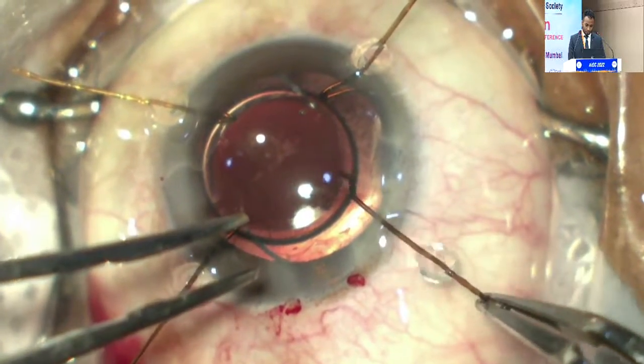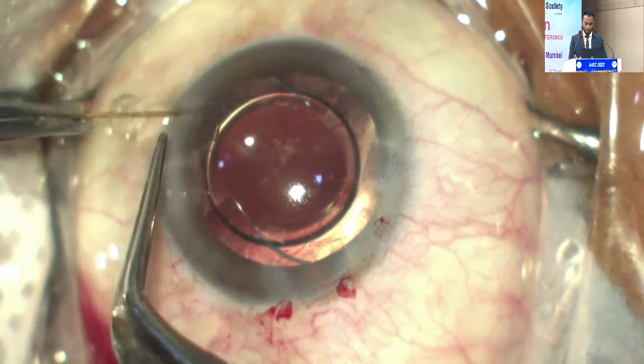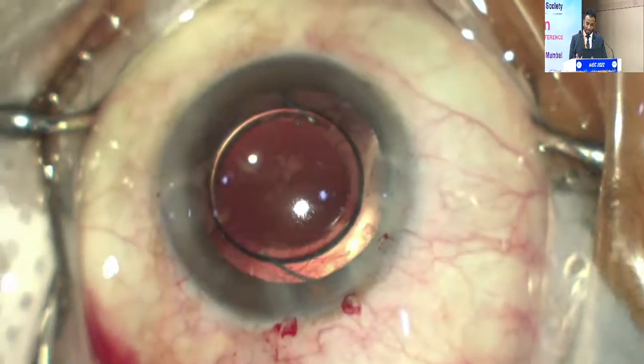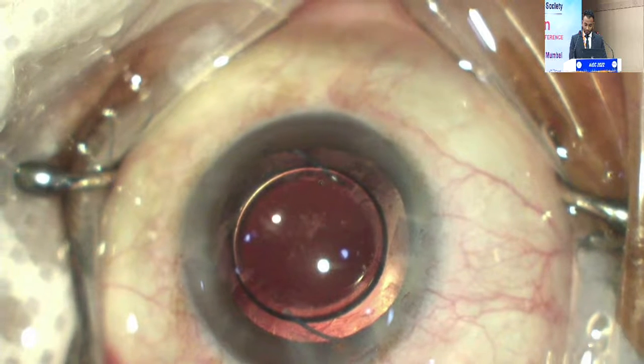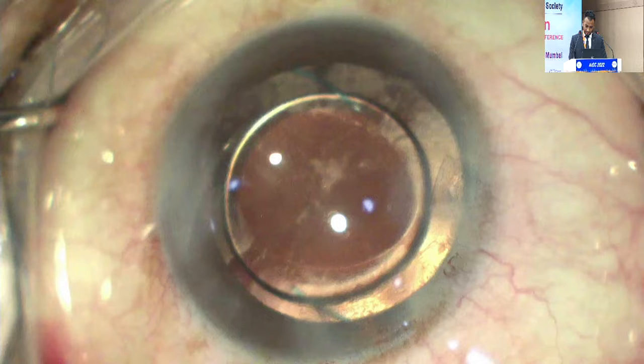Removing the viscoelastic. The bag looks very stabilized. I didn't want to put a CTR segment because it was a young patient, traumatic, and I felt the lens was pretty stable. So I did not want to do too much intervention. And that's it. That was the end of the case.